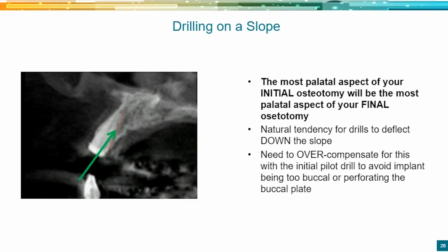Another one of the potential pitfalls is drilling on a slope. And drilling on a slope is a very, very important concept to understand. Sometimes it takes a little bit of actually seeing this in real life to really have it click. So hopefully if some of you have placed many, many implants, this maybe will ring a bell in your head, or maybe give you some insight.